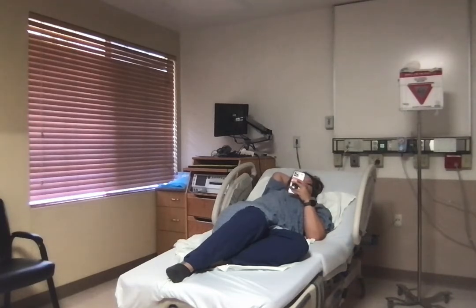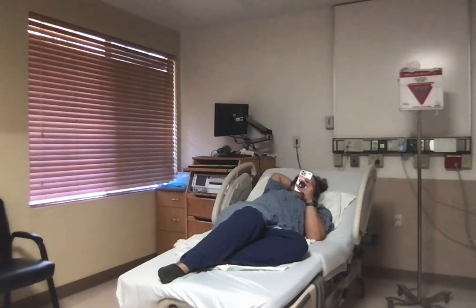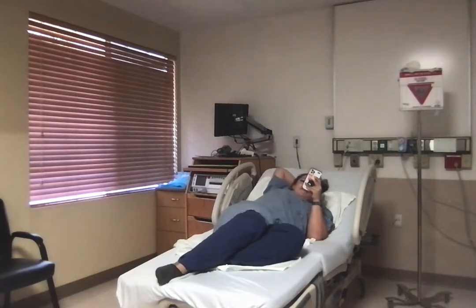5 minutes later, back at the nurse's station, Nurse Lake notices that the fetal heart rate began experiencing variable decelerations with removal of the pillow and returns to the patient's room after performing hand hygiene.